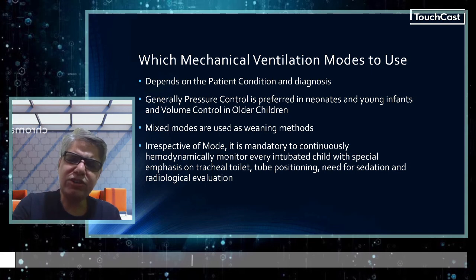But as a general rule of thumb, what I have seen is that pressure control is preferred in neonates and young infants, while in older children and adolescents, you usually go for volume control, assist control. Mixed modes, the SIMV with pressure support or volume control, are usually used as weaning methods before weaning a child off from mechanical ventilation.